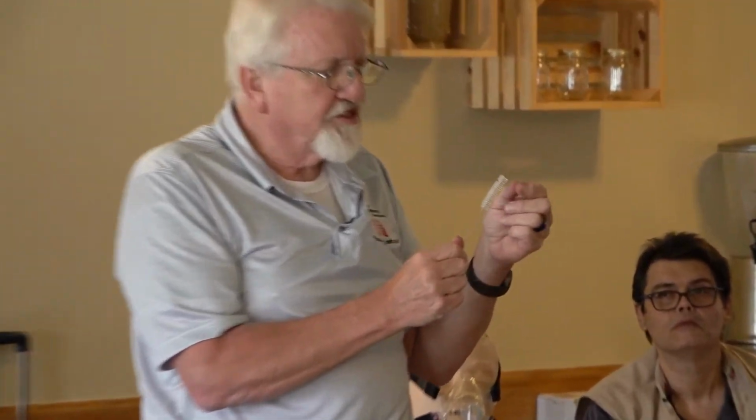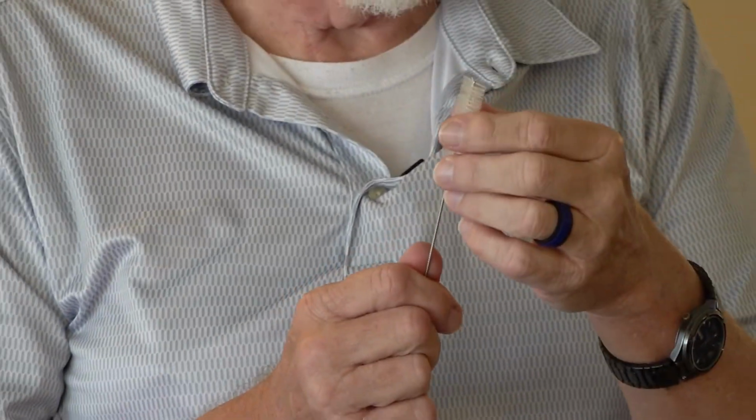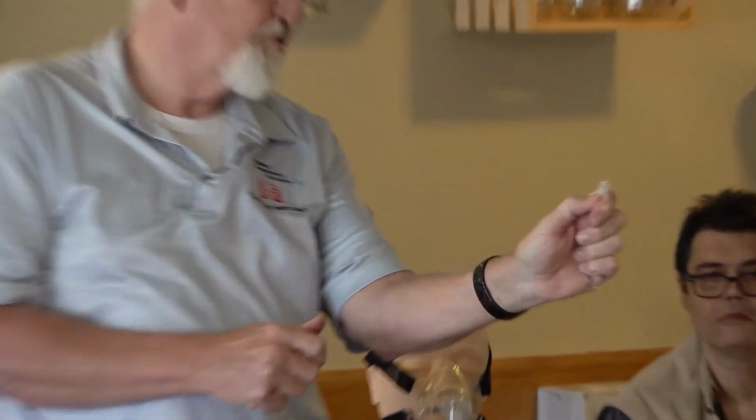The only difference is the diameter of the bristles are only going to be the same diameter as the TEP. Okay, so they're not going to be this. The opening in the TEP is about 1/8 of an inch, maybe 3/16 of an inch. And then the bristles are only going to go as far as the TEP is deep. So you may only have that much in bristles.